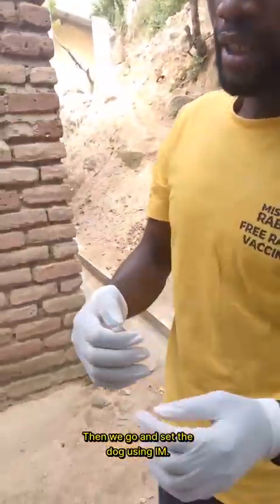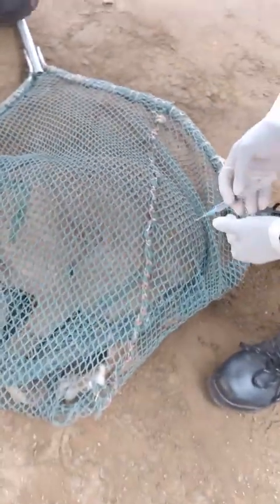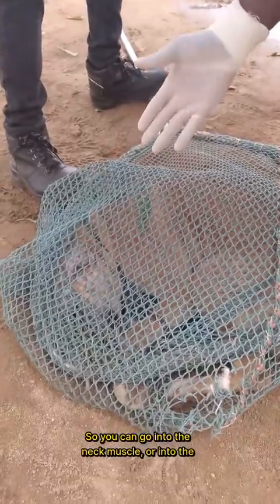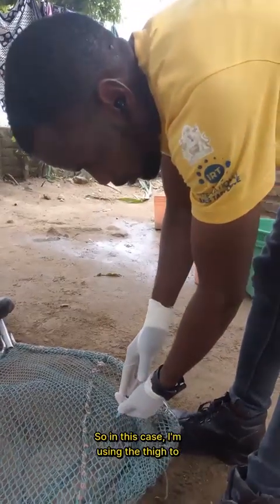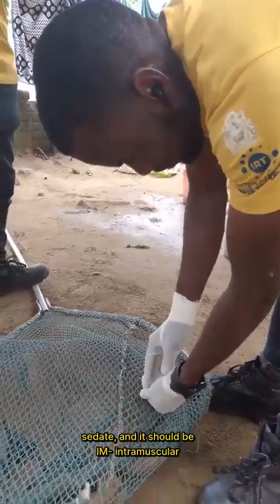Then we go and sedate the dog using IM. You can go on the neck, on the thigh, wherever you feel you have enough muscle. In this case, I'm using the thigh to sedate, and it should be IM.